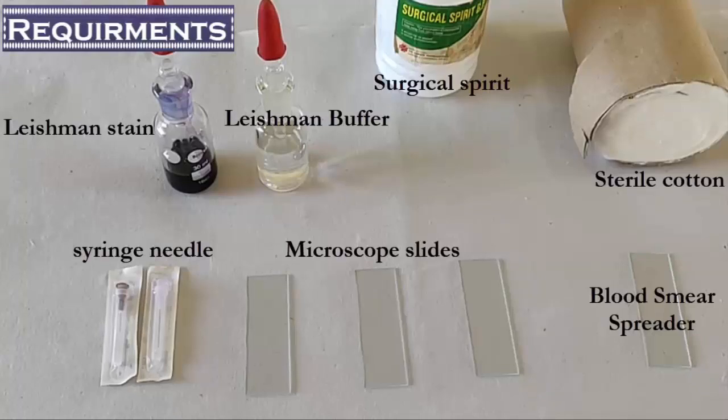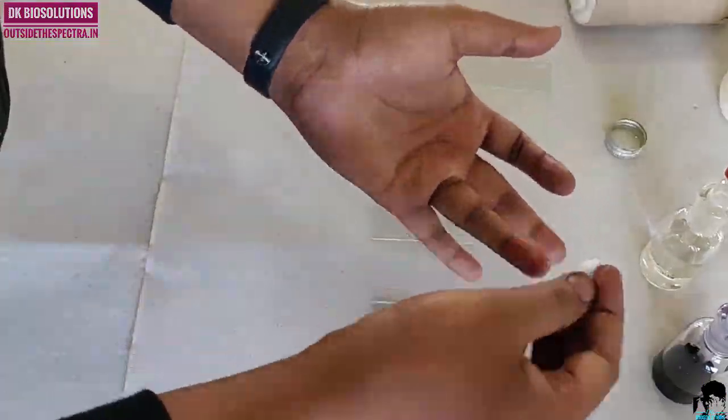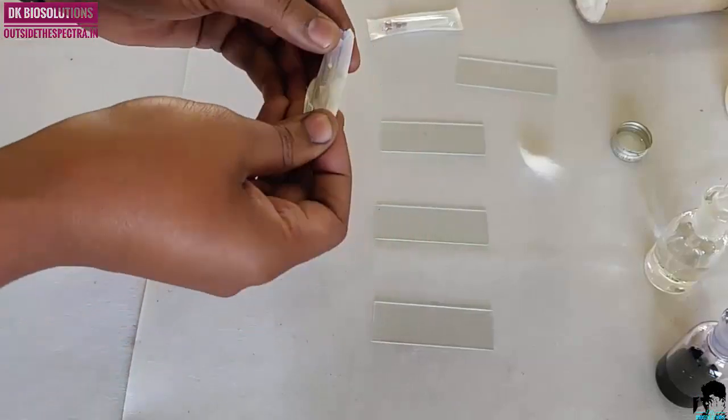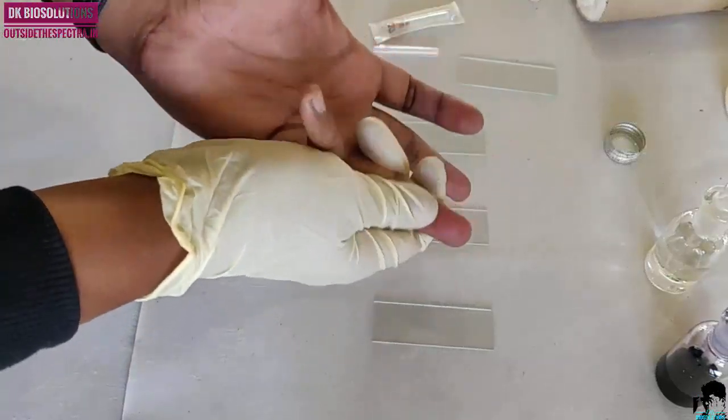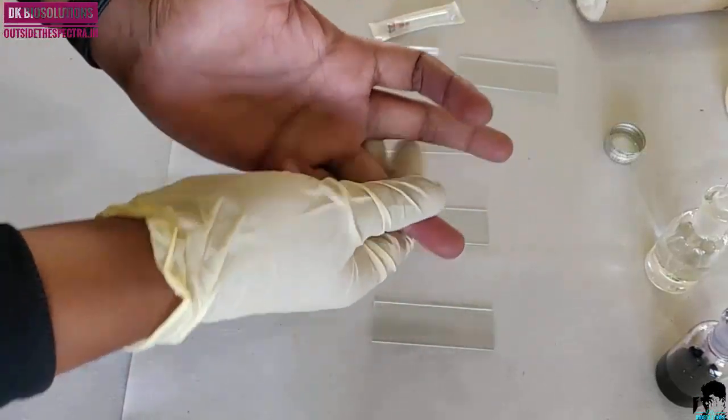Now, we will start with our blood film preparation. Sterilize your fingertip with rectified spirit and prick it with needle.